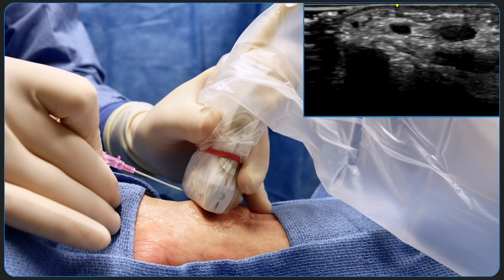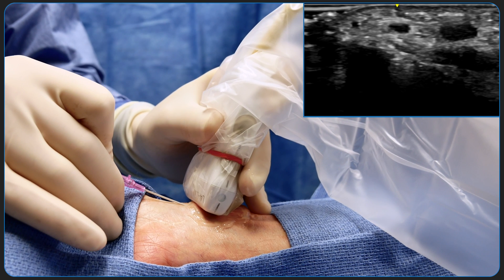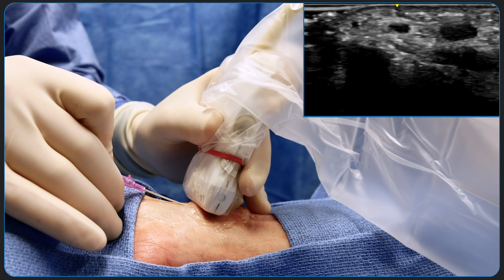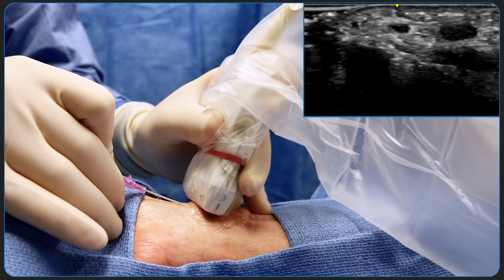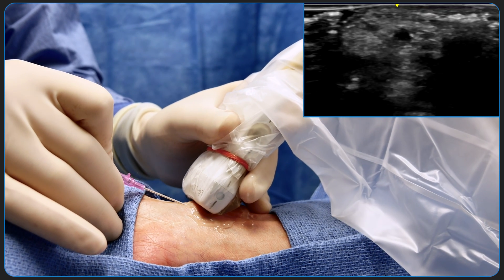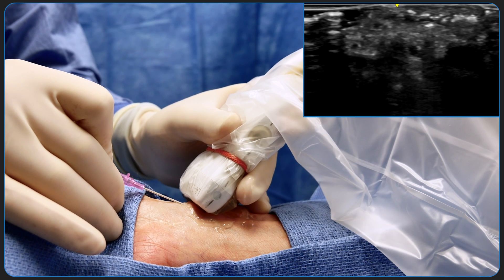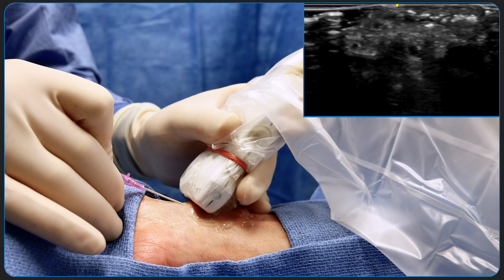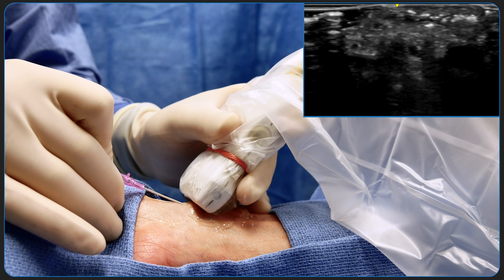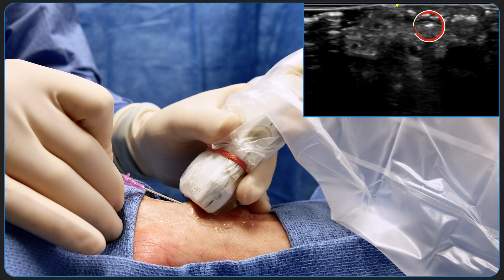The bevel of the angiocath is now advanced only to the point that the whole bevel is subcutaneous. The ultrasound transducer is tilted away from the entry site to position the beam approximately perpendicular to the plane of the bevel. Here, the tip of the bevel on the ultrasound image can be seen medial to the vessel.